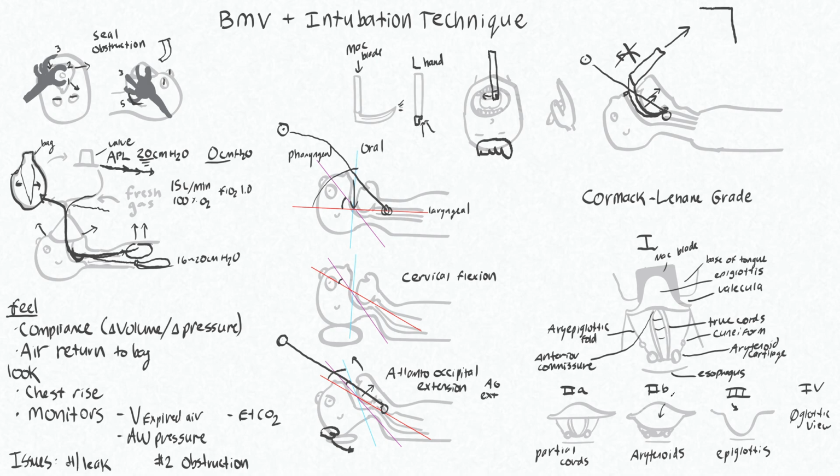So sometimes you will put your direct laryngoscope in, and this is the view you'll get. So it's close, but not quite there. We talked about making sure you're getting the blade tip inside the vallecula, but another maneuver you can do to help out is called BURP. This is backward, upward, rightward pressure. So you are going to do this.